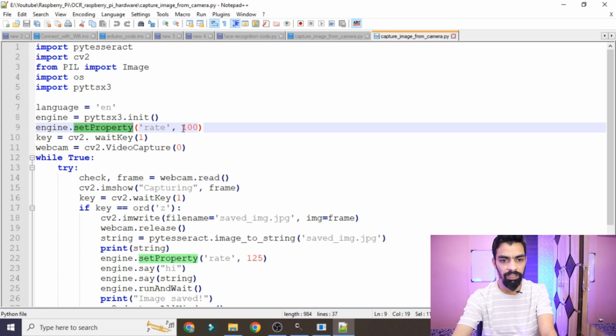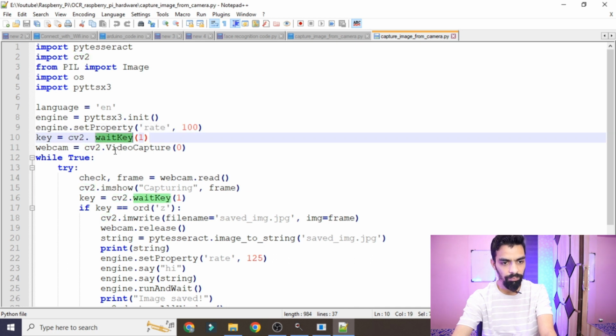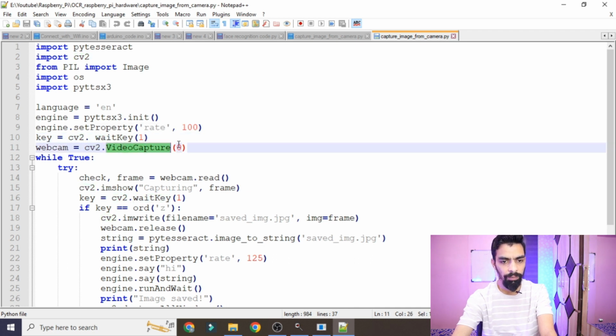That speak rate is nothing but the 100. You can change your speak rate according to yourself, so I prefer 100. So engine.setProperty, we change the speak rate. Then after that cv2.waitKey. Then cv2.VideoCapture(0). So basically I am using the USB camera, so I have given 0 here.